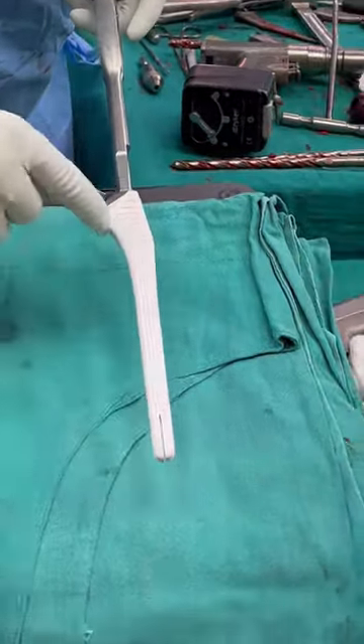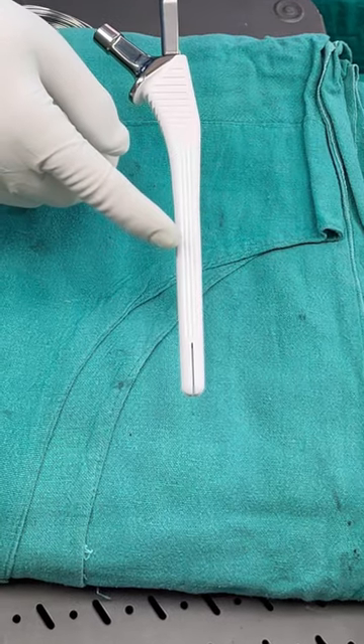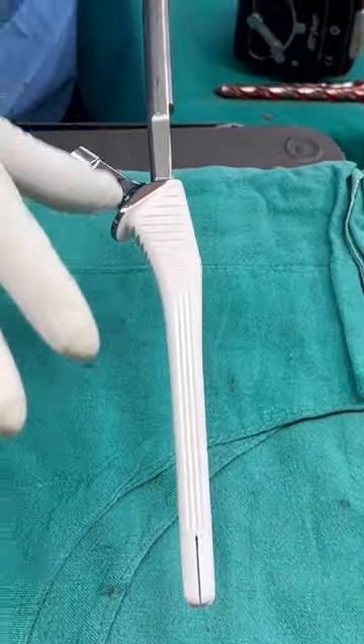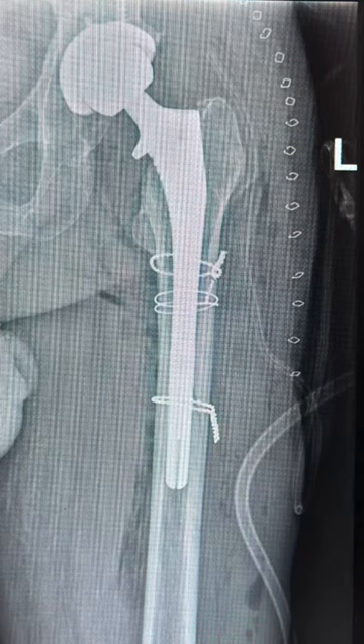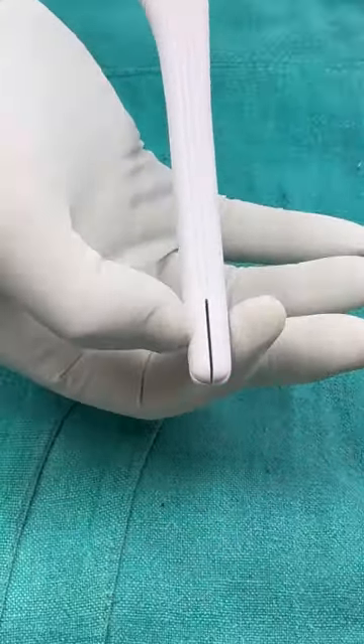This is the uncemented fully H.A. coated long stem. The normal stem length is still here, which is used in normal hip replacements. But in complicated, complex, or revision hip replacements, we use a longer stem which has extra length that fits into the femur bone.